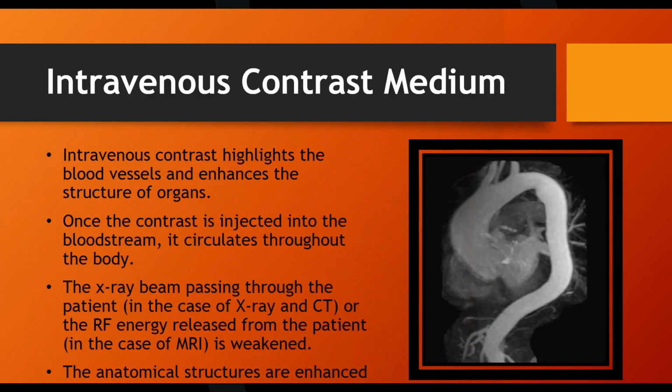All right. So for MRI, it's the exact same setup, syringe, and it's a clear fluid and everything, but the magic ingredient in MRI injector contrast fluid is gadolinium. What gadolinium does, without going into detail about how an MRI image is produced, basically, well, here's how it's produced. The most scientific way I can put it, it's magic. You just have to hit the I believe button. Put him in a magnet, you get the image.